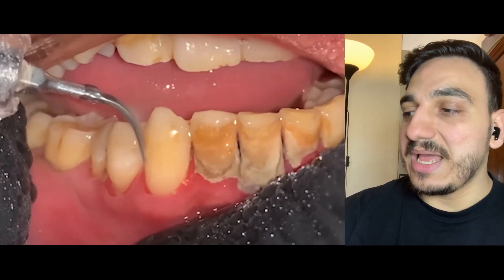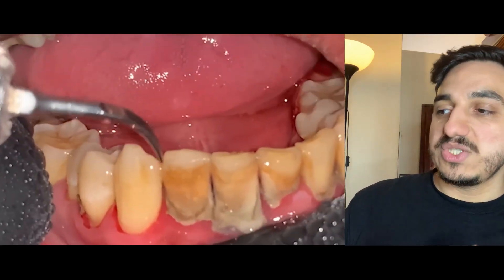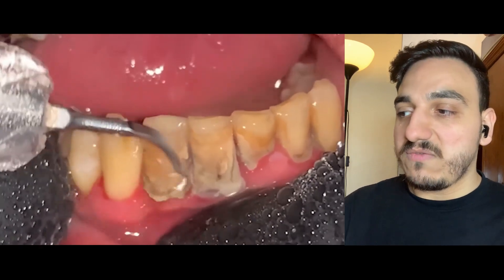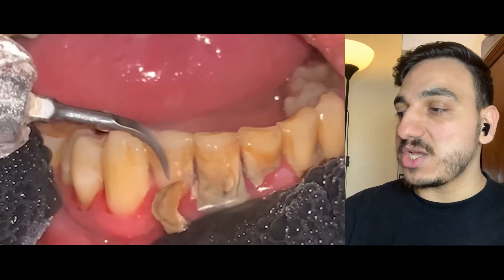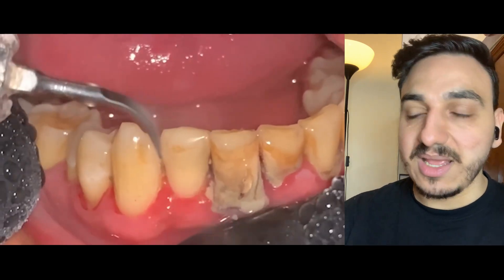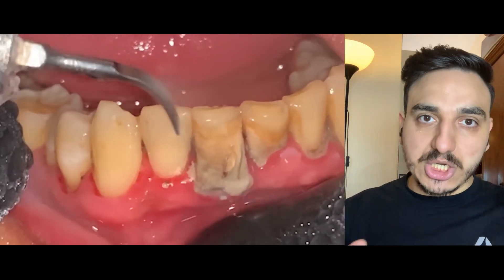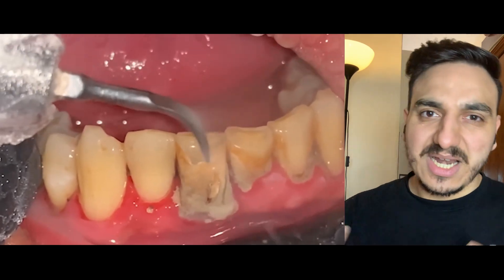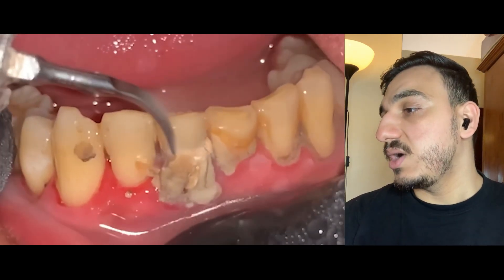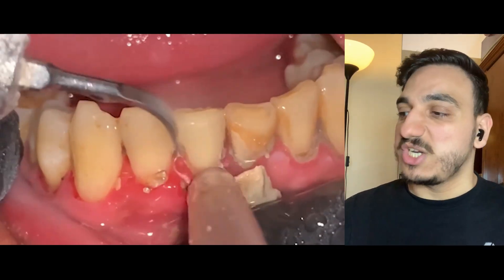Look at the difference as the operator gradually removes these stains. This will enhance the aesthetics of the tooth, but if the person wants further enhancement there are multiple options to improve cosmetics. For example: teeth whitening is feasible. Other examples are veneers. In certain cases where teeth have had root canal treatment done before, we may also go for a crown on certain teeth to help protect them from fracture.